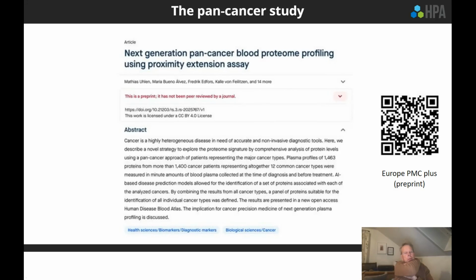But at the same time, you look at those AUCs that you showed, and you see 1 and 0.99 and 0.98, and these are remarkably discriminatory. Being able to detect cancers, I think the unusual approach in your work was that you were looking for the unique signature of each of the 12 cancers.